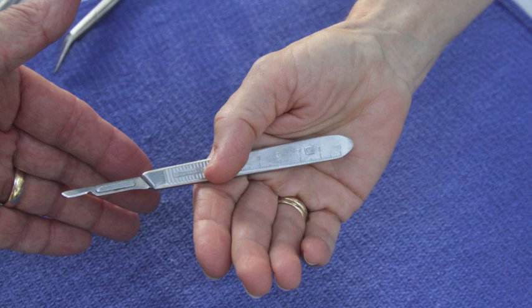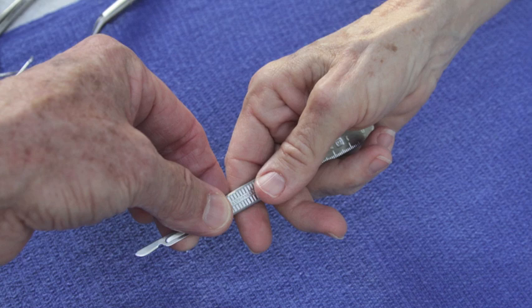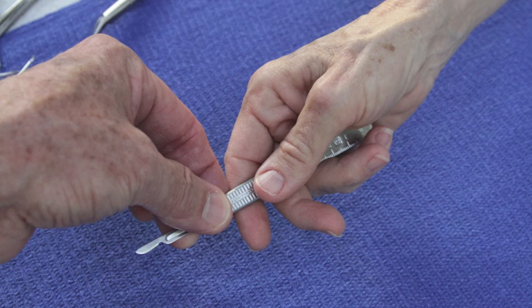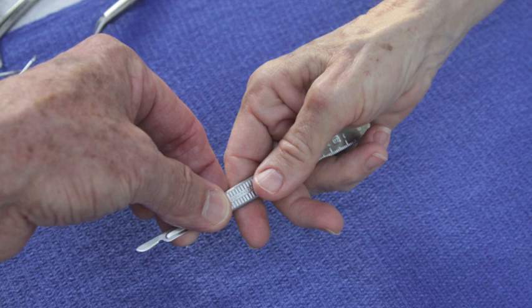The surgeons that you're going to be working with are very, very experienced, and they have a way of doing things that is safe and effective. In an individual circumstance, let the assistant show you how the surgeon likes it, or if you're working directly with the surgeon, have the surgeon show you the techniques that they want you to employ. Because these instruments are so sharp, safety is of paramount concern. It is the responsibility of both the surgeon and the assistant to be able to function together.